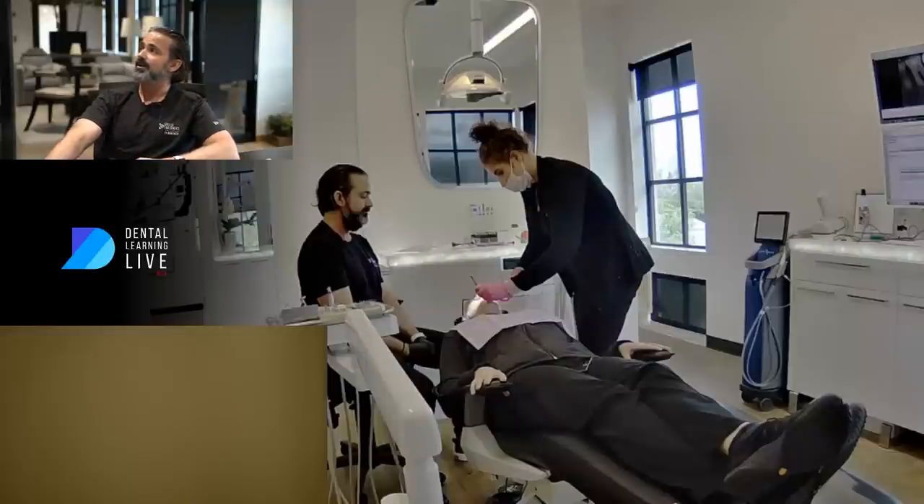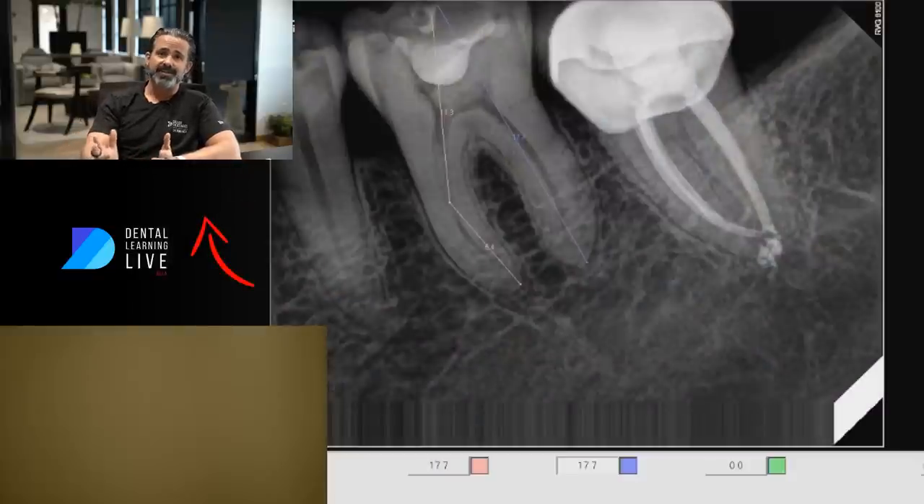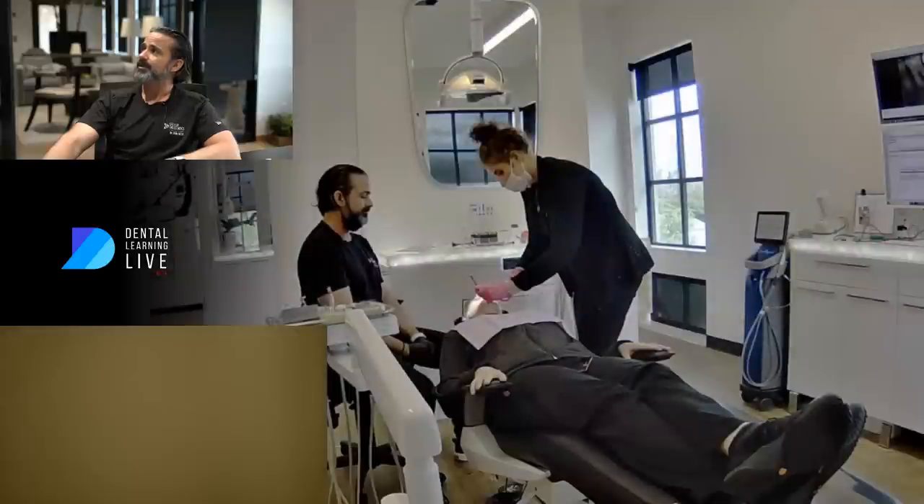We're going to get started here. Let's just look at this little x-ray. So it's tooth number 19, and it's one of those classy cases I've been getting a lot lately where we've got a deep filling, a pulp horn exposure right here, and some recurrent decay. The patient came in with a pulpitis and tender to percussion, so we've got acute apical periodontitis going on. I'm just taking some lengths here and the workup's going to be just right. Let's go to my screen and get started.